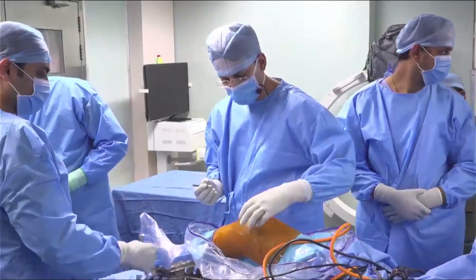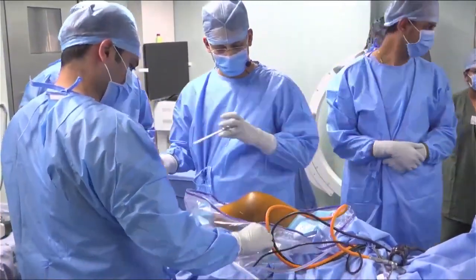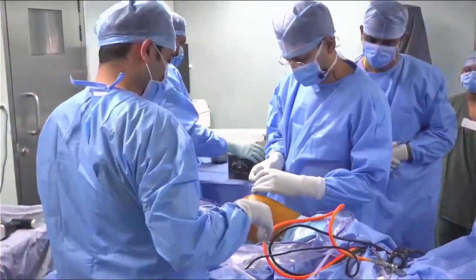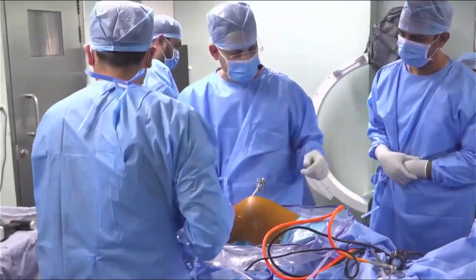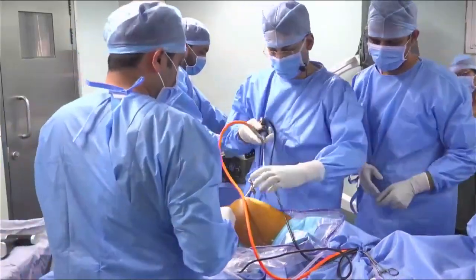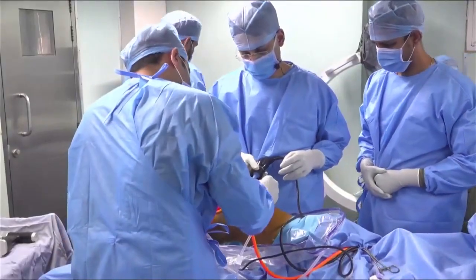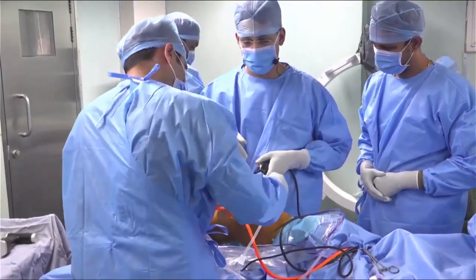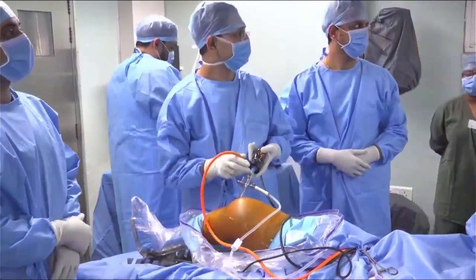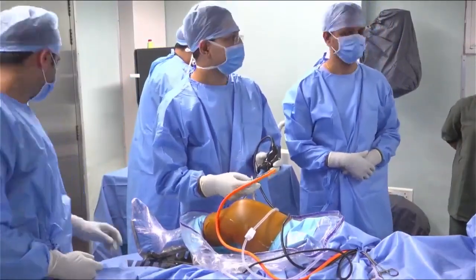So now we'll start the case with a diagnostic arthroscopy. And we can see that there is serous fluid which is coming out. So now, needle please.